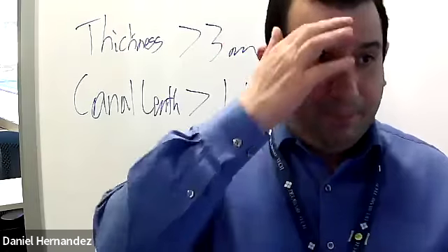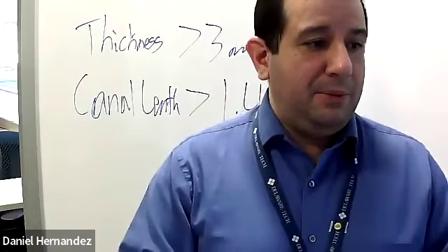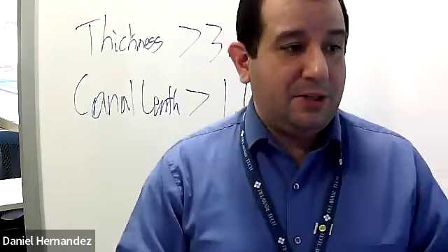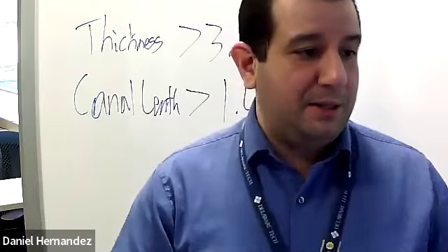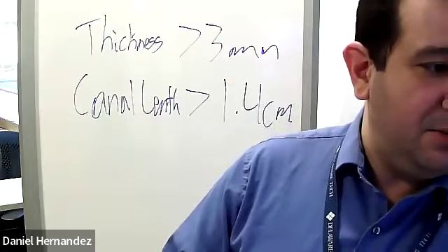So we can try supine. We could try decubitus positioning, which might help you as well. This allows for maximum visualization of the stomach and pyloric canal. This is most advantageous for documenting the transit of gastric contents into the bowel.